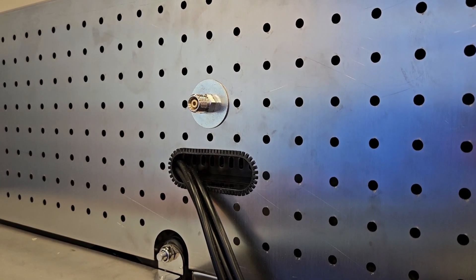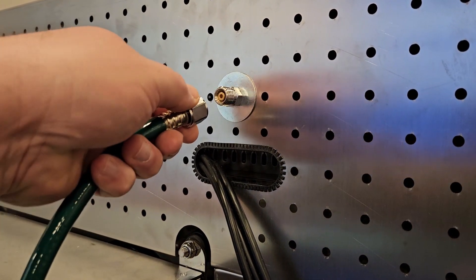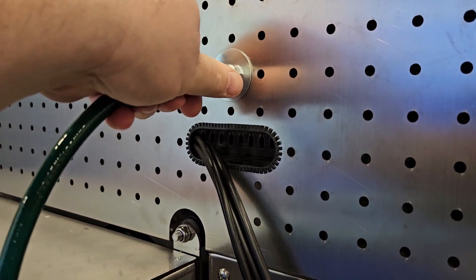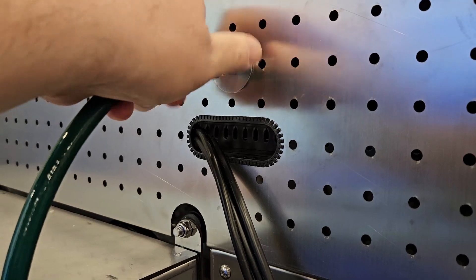The back of the unit will have a male DISS line to connect your oxygen to the cage. Due to the wide variety of oxygen setups in clinics, it is recommended to speak to your oxygen supplier or a distribution partner about the best way to connect your oxygen to the cage.